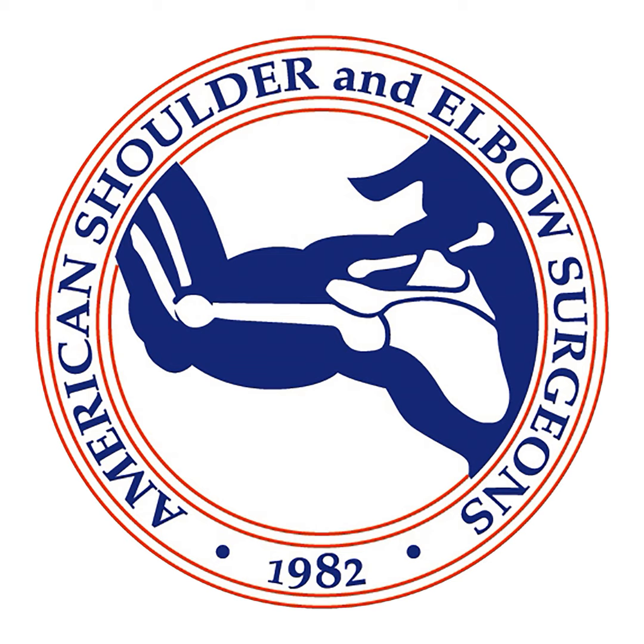The other thing I would say is the efficiency of the procedure. As a lot of us have transitioned to doing outpatient arthroplasty, and as Mike and I were talking about before the podcast, we have a lot of traveling nurses now at Mayo, and having one pan with simpler instrumentation for stemless is also a nice feature. So we put all of that together with great radiographic data. So I think that stemless, its time has come, and for me in my practice, it's become the standard of what I do.